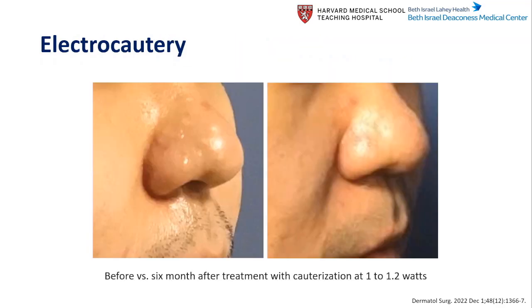The second technique, we just got the paper about 2 years ago. They used a regular electrocautery, and they basically ablated the epidermis and a little bit of dermis just within the papular scars. I have to agree with the authors of this paper that special caution is warranted, particularly in patients with skin of color. I think this technique may cause dyspigmentation.